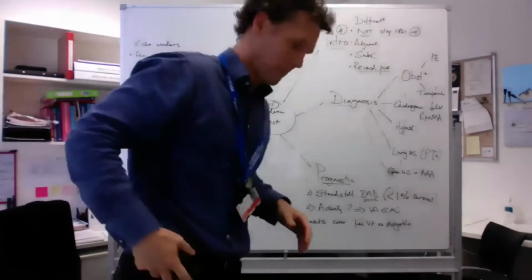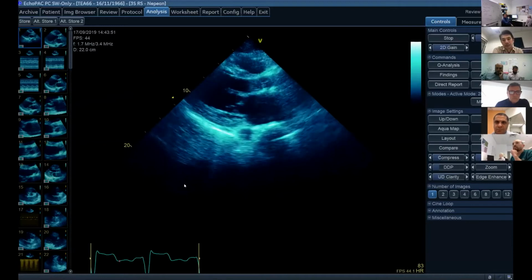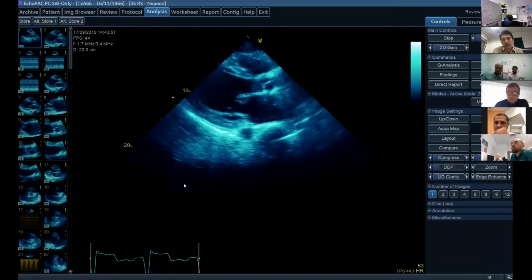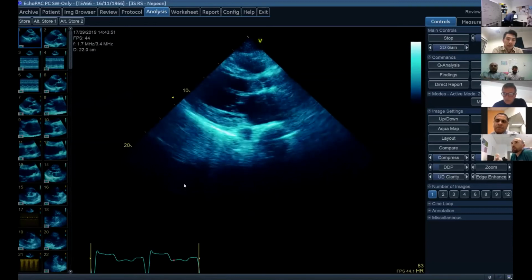All right. Should we go through a case? Mm-hmm. All right, so I'll give the case vignette first. This is a mid 50-year-old man with a history of hypertension, hyperlipidemia, who I was asked to perform an echo on in the unit. He had come to the unit following a Met call, where he essentially just looked really, really crap.